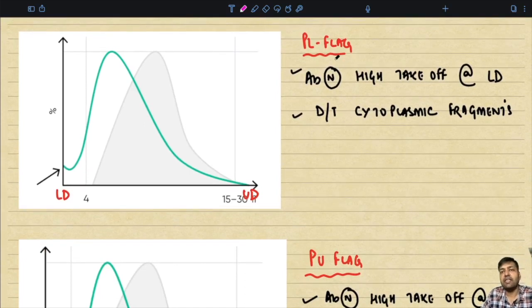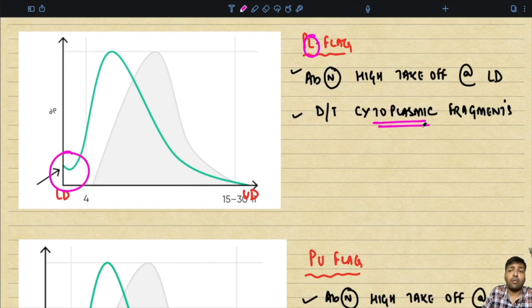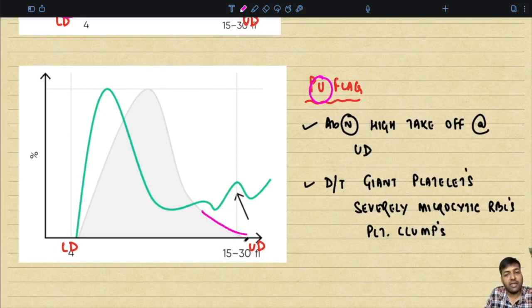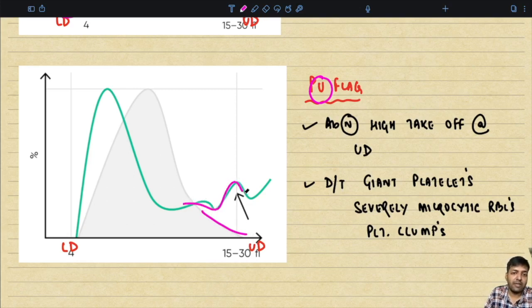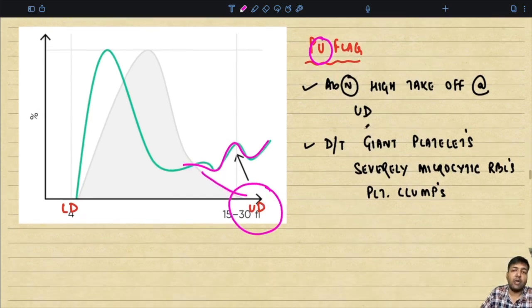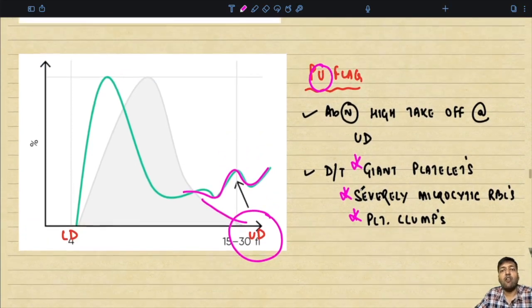Platelet flags include the PL flag, where at the lower discriminator there is an abnormally high takeoff, occurring because of cytoplasmic fragments. There is also the PU flag, where the histogram is not touching the baseline at the upper discriminator. This mainly occurs because of the presence of giant platelets, severely microcytic RBCs, or platelet clumps. With this, we have completed all the different kinds of flags.